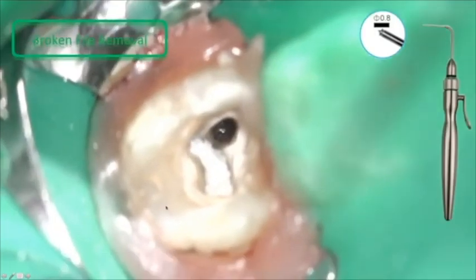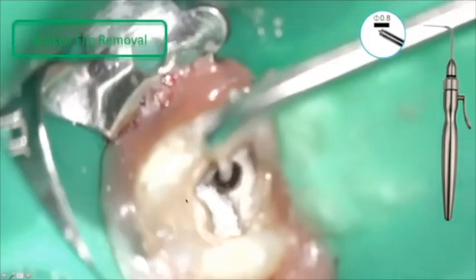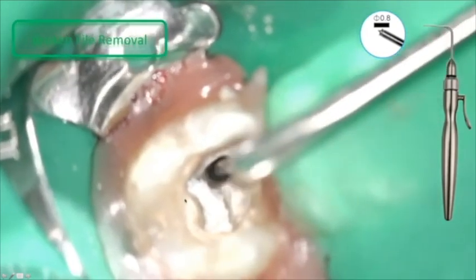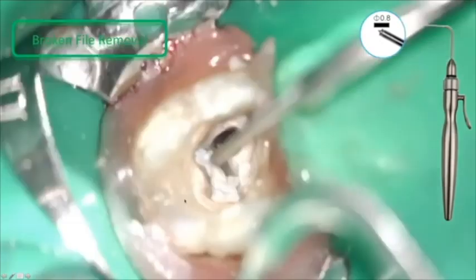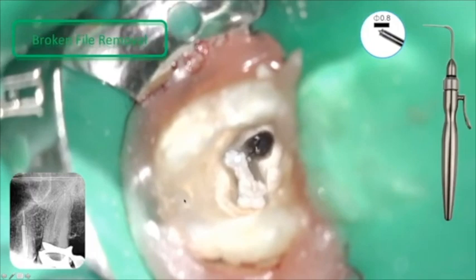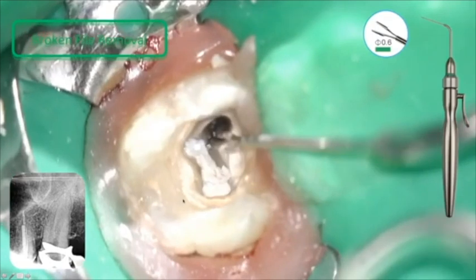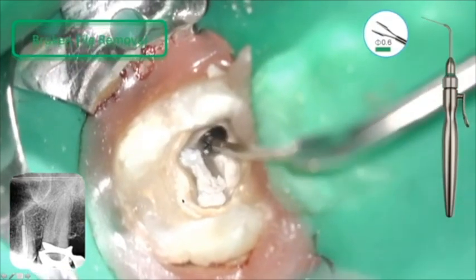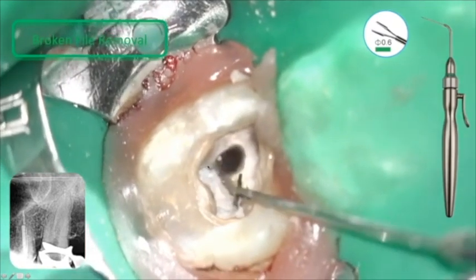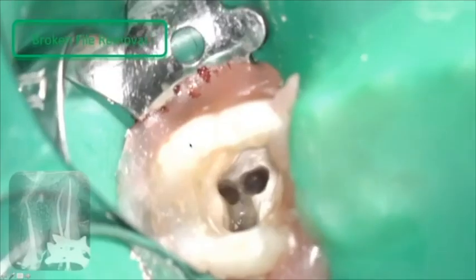So now I'm moving to the extractor of Zoomax. Here, when I have 1 millimeter of the instrument free at the coronal part, I can try to grasp it with the extractor. First time, second time, and at the third time I can grab it and it's out. I can see it, it's at the entrance of the canal. Now I switch back to the micro tweezer and I catch it. So this is for the maxillary teeth.